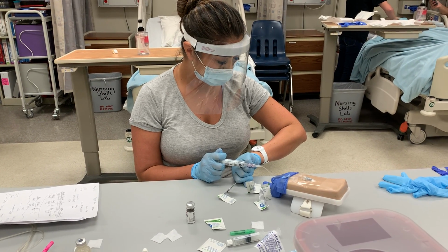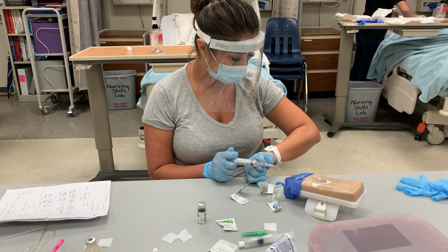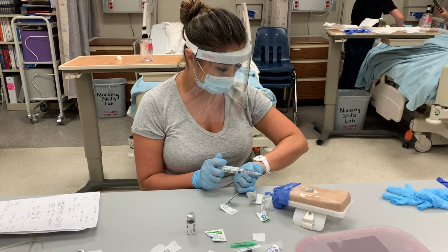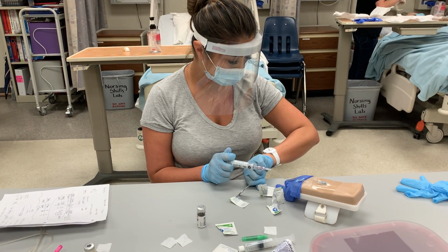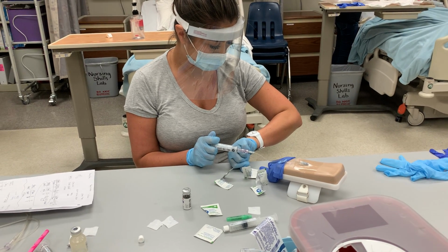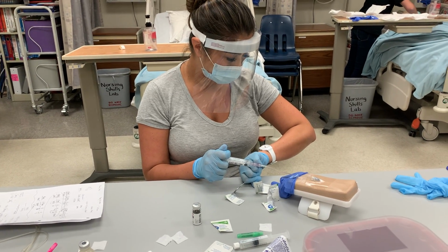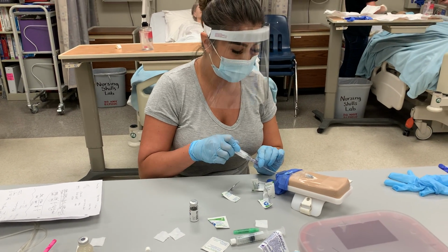Everything will be clean. Almost done. I'm going to mark the date and the time that I applied the pad. All right, that is the last of it. So I will mark the date. Okay, how are you feeling?